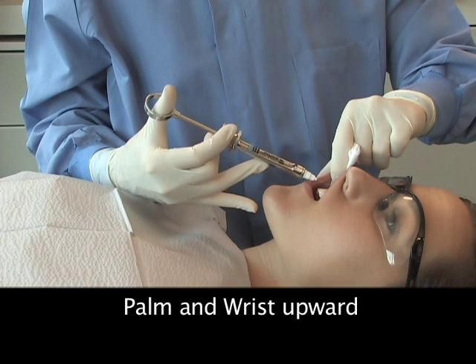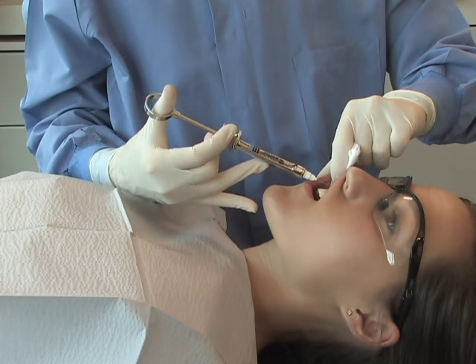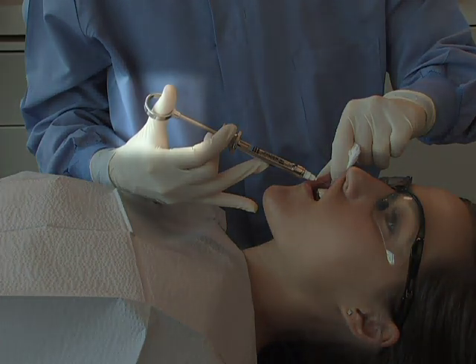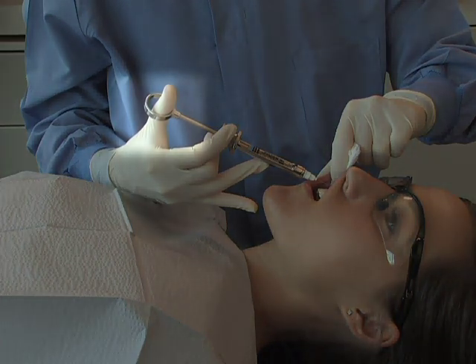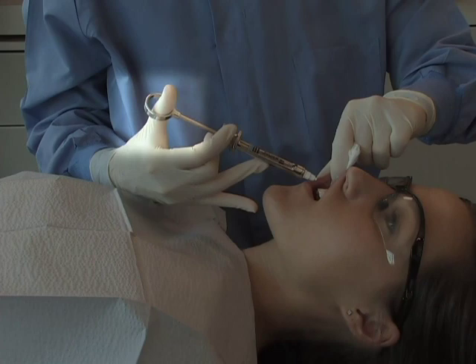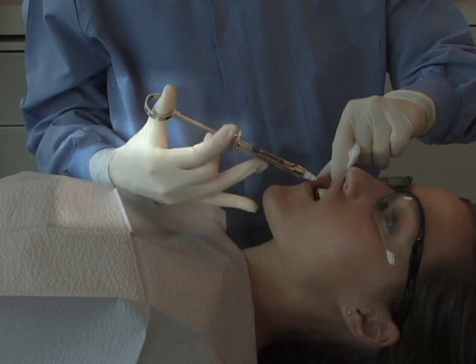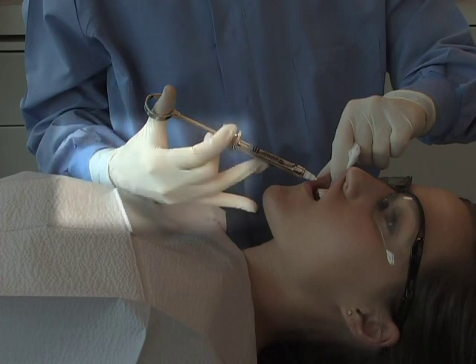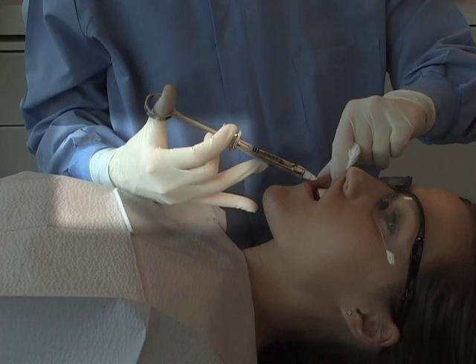For better control of the syringe during aspiration and deposition, the pad of the thumb should be placed on the thumb ring, and the ring should not slide below the knuckle. With the syringe securely placed in the hand, the palm and wrist should be facing upwards toward the ceiling. This allows the operator better control and comfort throughout the injection.